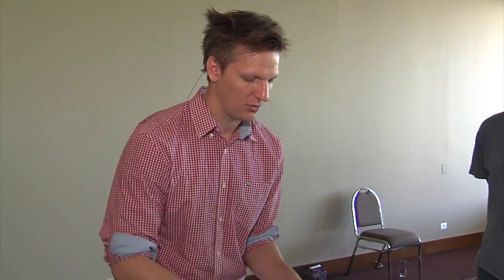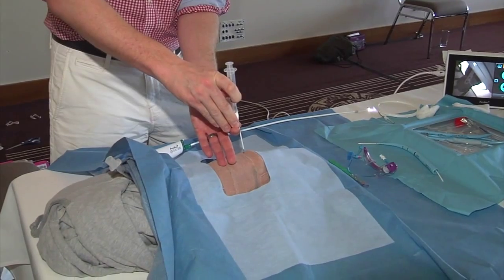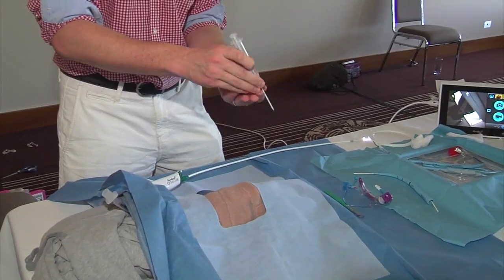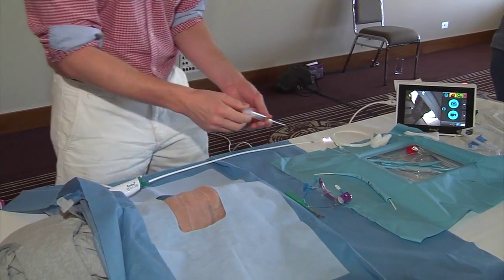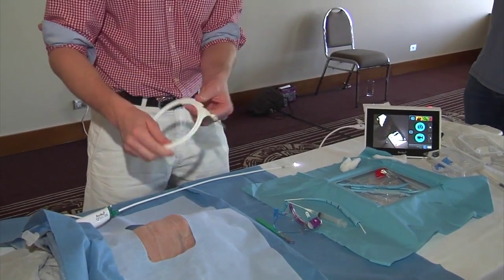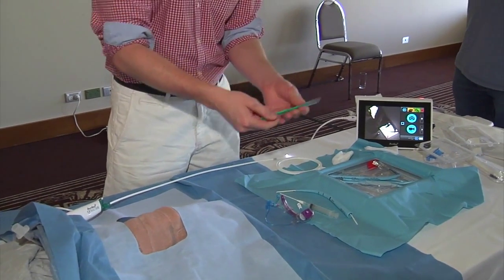Introduce your cannula over needle into that spot, basically perpendicular to the skin. You'll directly visualise it with the bronchoscope as the needle and cannula enter the airway. Slide the cannula off the needle, leave the cannula in the airway, and introduce the guide wire down through it. Once the guide wire is in, you need to make an incision with the scalpel.